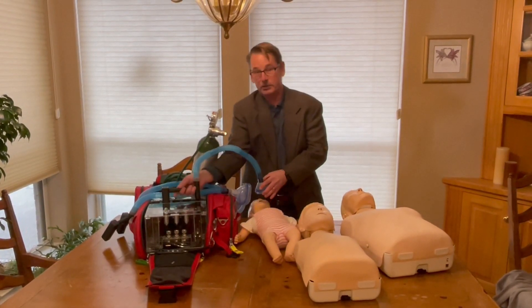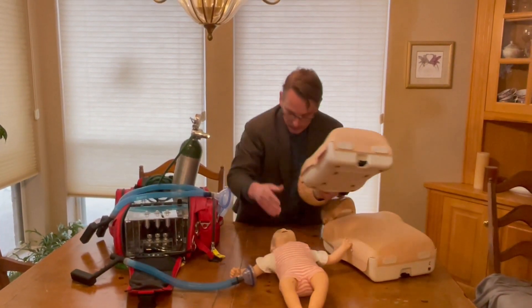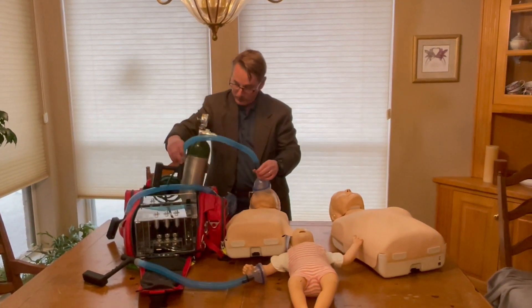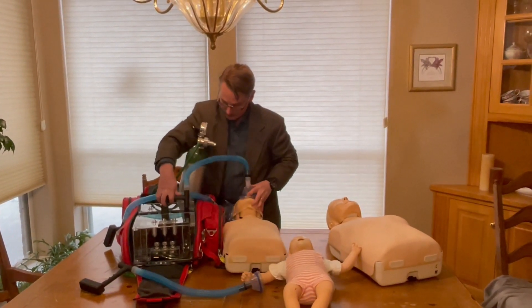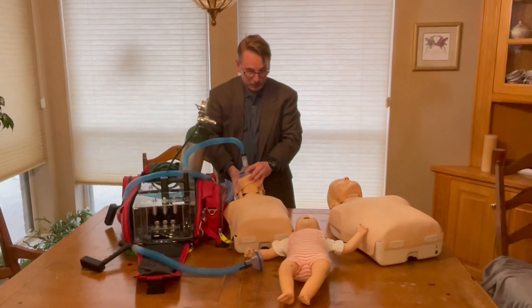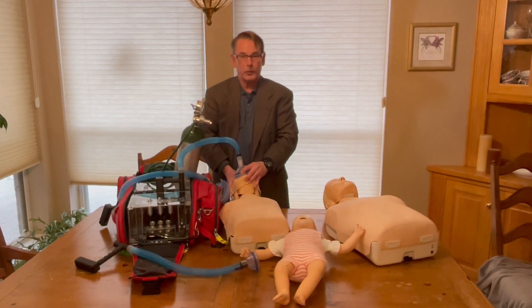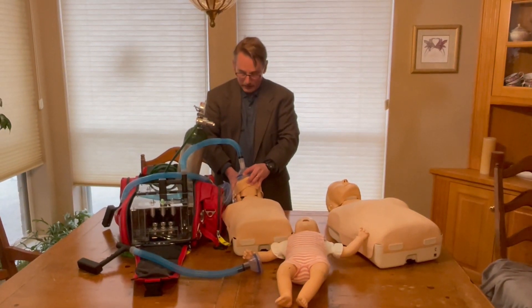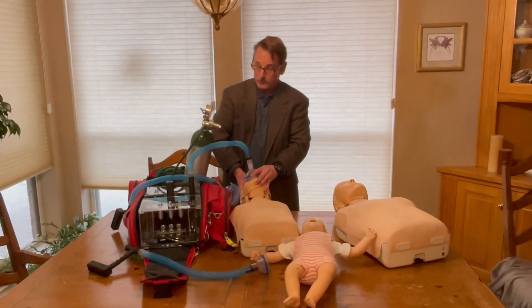Should you instead decide you need to do rescue breaths for a child, you simply select the child mask. A keying system tells the device which profile to deliver. When you hook it up, you can now see the little chest going up and down. That's at a tidal volume of 300 cc, a respiratory rate of 20 breaths per minute with the breath given over one second and four seconds of passive exhalation — again, at 100% oxygen concentration.